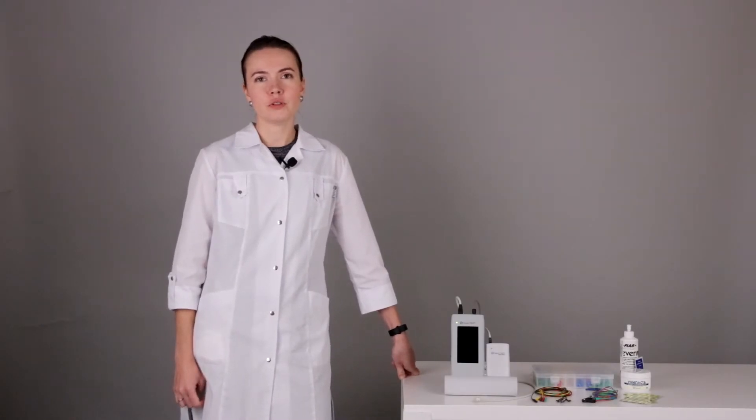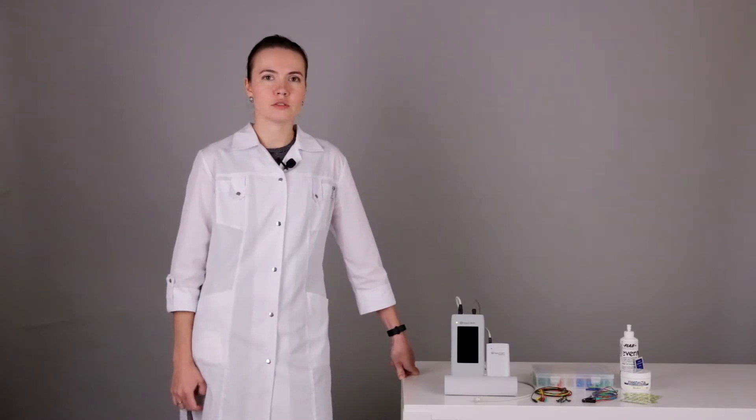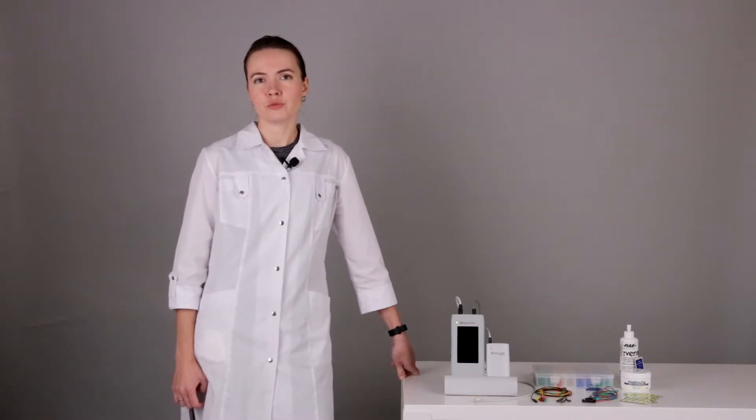The AABR test is very simple and can be performed by a technician because it doesn't require any inspection by the doctor. The room where you will perform an AABR or ABR test should have good grounding and the environmental noise level should be low enough.